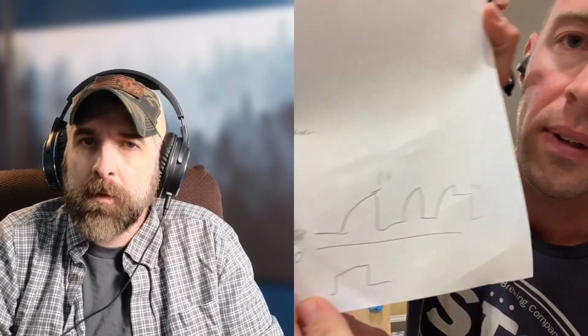But if you develop a compliance problem or a resistance problem, then it will deliver a pressure of 30 and your tidal volumes will start to shrink. That can be your key, because it's pressure regulated. They'll call it volume control, but it's a pressure regulated volume control. On a pressure control mode, it's a flat waveform as opposed to this shark fin waveform, so your peak and your plateau are almost the same. That's your pressure control waveform, which is probably what you're used to seeing on the Impact. So they should be the same unless there's an airway resistance problem. Does that make sense?